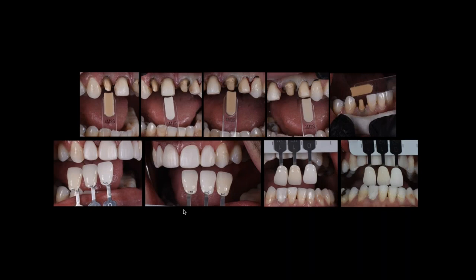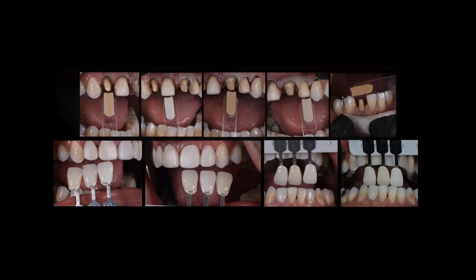Again, I went through this in material selection or a few of the webinars that we've done, where we talk about space and how much space we have and how we fill that space with which material, and which material works best optically to fill that space. So in this particular case, we're doing 4 teeth. I'm also doing a 5th tooth on the lower. He had an issue with that lower lateral, so I'll be restoring that one too.